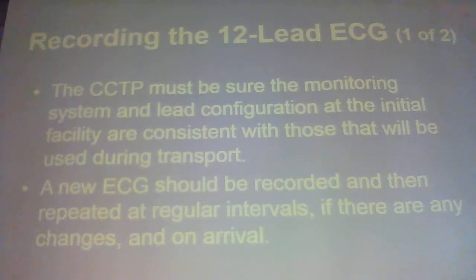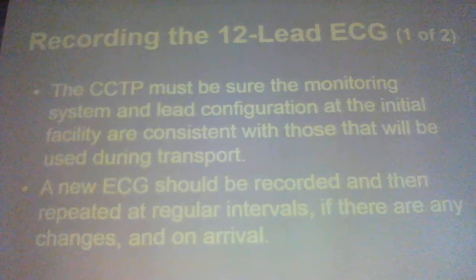So I get this guy with 8/10 chest pain. I give him his aspirin, I give him a nitro, 5 minutes, I check him, he's at a 5 now. Push the button. 5 more minutes, he's at a 3. Push the button. I've had as many as 9 or 10 12 leads between the scene and the hospital before.